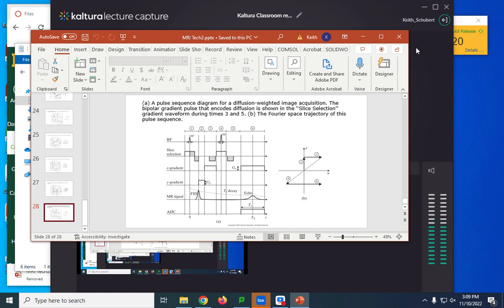In the 1980s, this was typically, say, half to 1 Tesla, and now it's up to 10 to 12 Tesla. So is that also making MRI time shorter, which means you could get better resolutions? Because the resolutions were nowhere near as good back then as they are now. Right, and they're taking about the same time because that's the limit of what a patient can sit through, if nothing else, the bladder filling. So essentially the bigger we make the field, the faster we can take the measurements, and the higher resolution we can give to doctors.